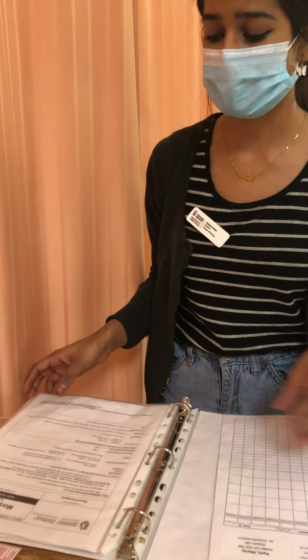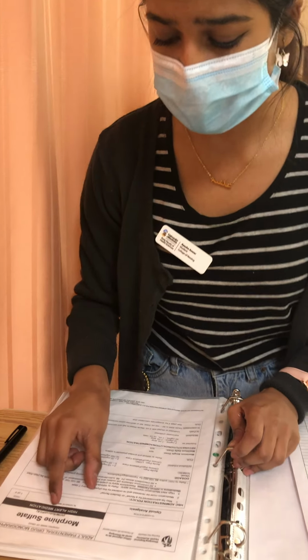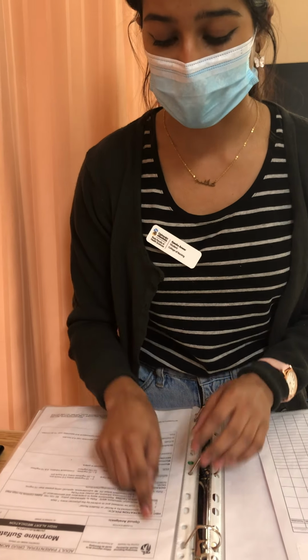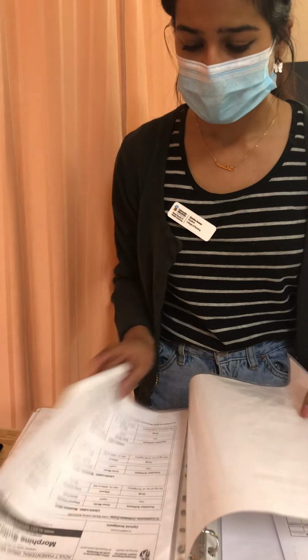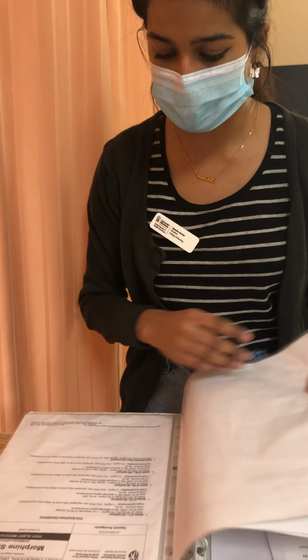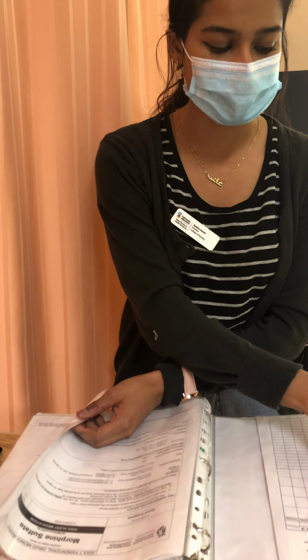Now I'm going to look at the PDM. So we have morphine sulfate. It's a high alert medication. It requires a 2-nurse check. It's an opioid analgesic. It can be administered by a nurse or student nurse. The dose range would be 1 to 10 milligrams per ml, and the usual dose is 1 to 3 milligrams.